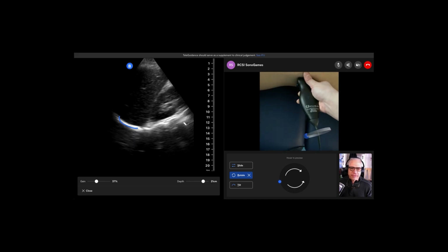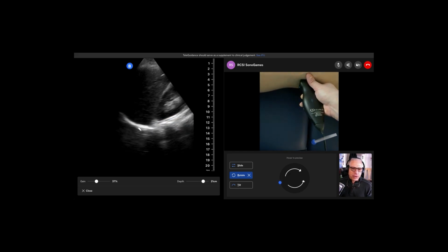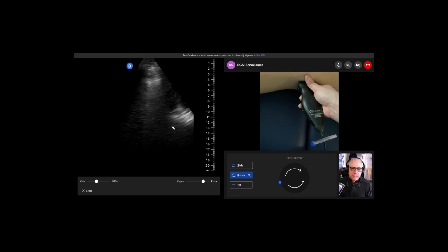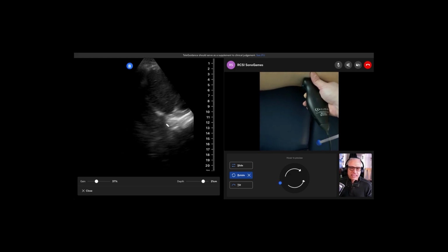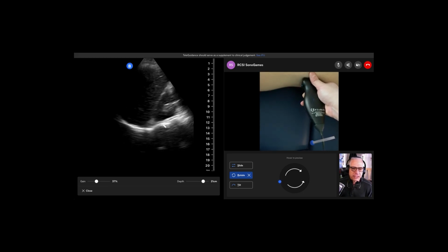Because here's that diaphragm, and here's this white. What's this white over here? The spine. Exactly. So what happens when Greg breathes? What happens to that spine? It should move down. It goes away, right? Yeah. Because this is all full of air, and because air doesn't conduct sound, every time lung goes over anything else in tissue, it obliterates that tissue.